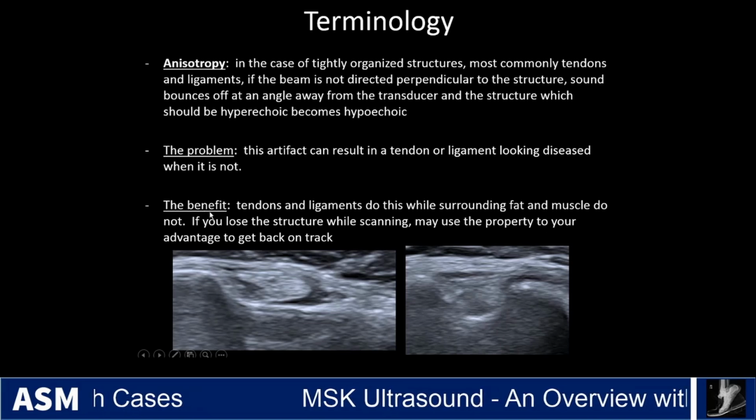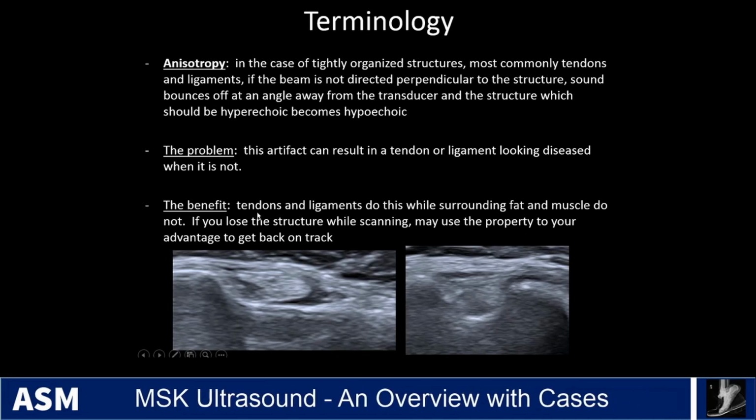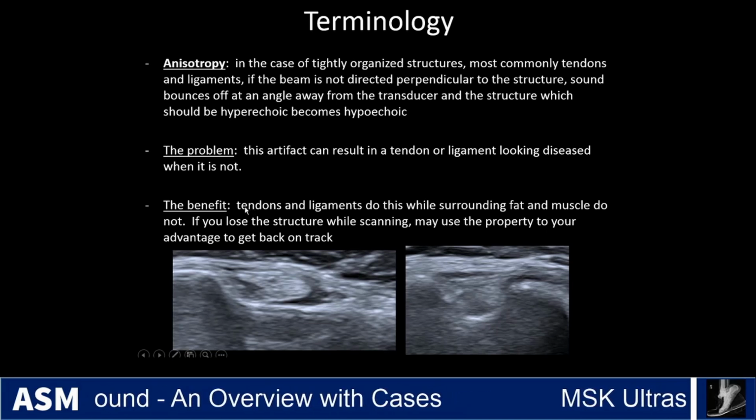This can also be a benefit, because if you're not sure if you're seeing a tendon or a ligament, you can use this artifact to your advantage to say, yes, this is a tendon. And so how do you beat this? Well, you rock the transducer.